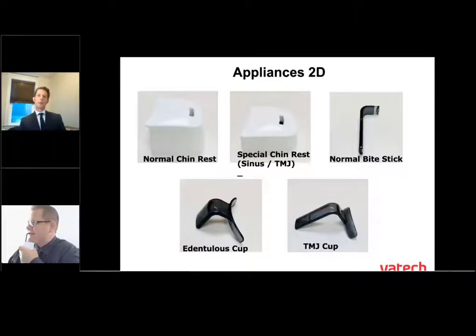All right. We all know we have our patients that have either class 3 or where they can't bite right into the bite stick. A lot of times what patients will do, or our fully edentulous patients, we do have our edentulous cup. So I really want to make sure everybody notes this. It's the edentulous cup right there, and that's going to fit right to the patient's chin. So Paul's going to take the bite stick out, and he's going to put that edentulous cup in there. And then really what we're going to do is have our patient put their chin right into the chin rest there and just rest on that, or right up against it. And that's going to keep them from moving too far anterior or posterior. This will also allow us to still properly line up that canine light.